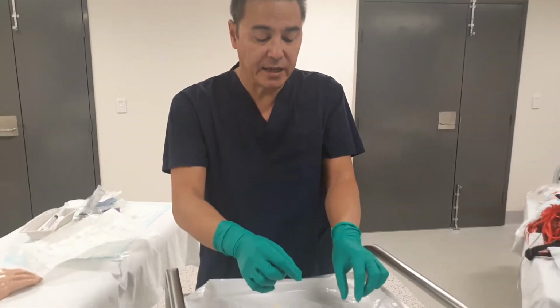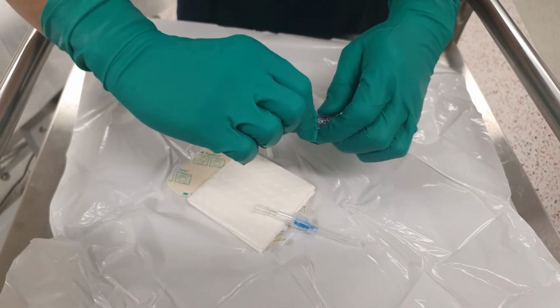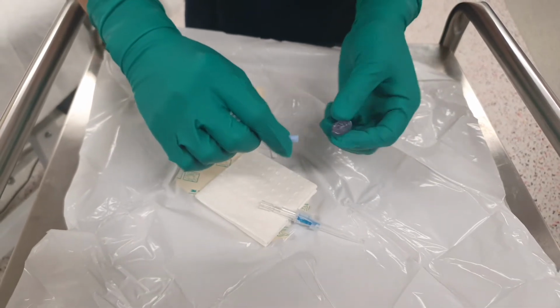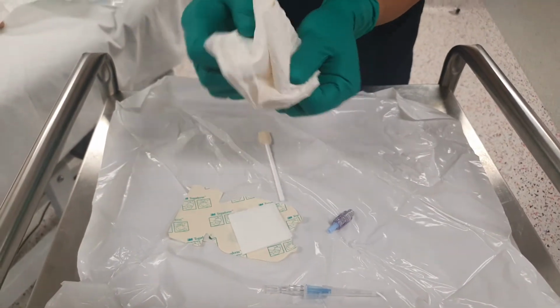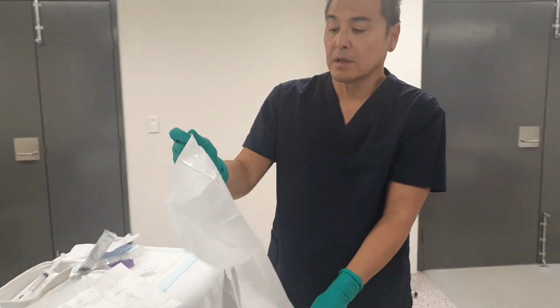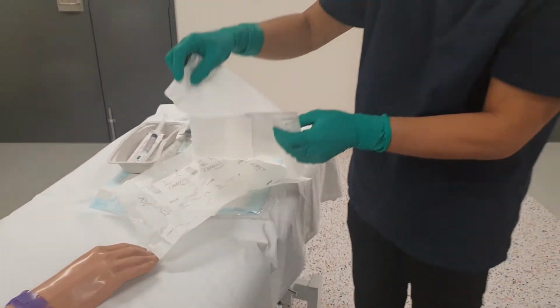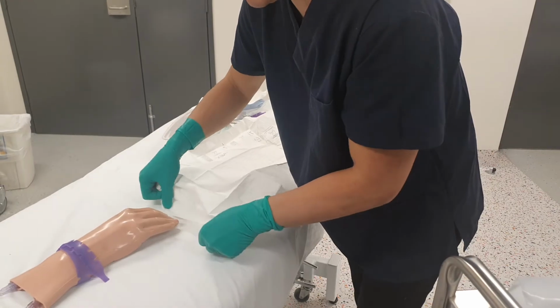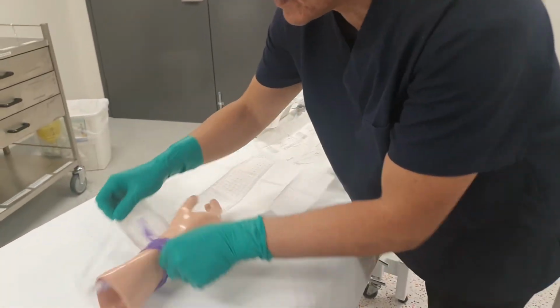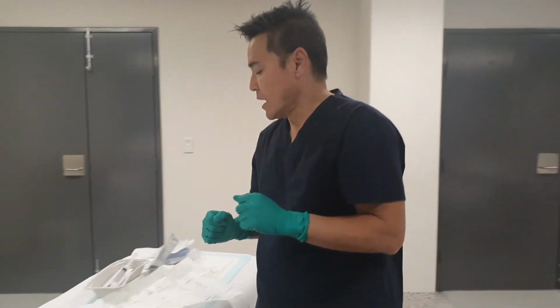Now, just a handy hint, with my cannula cap, I like to just loosen the cannula cap cover. So it's going to screw in like that, all right? So I just like to loosen it. Okay, this drape here, I use the shiny side of the drape down and the rough side up, so that any blood coming from the patient, I get the patient to lift up your hand, sir, okay. And I've got a clean area to work in.